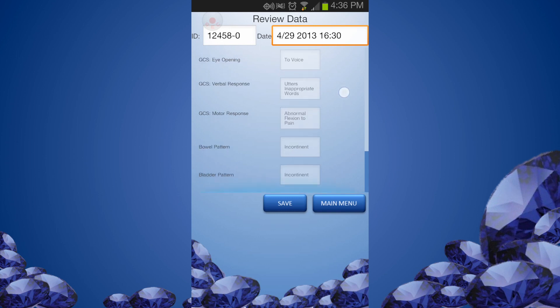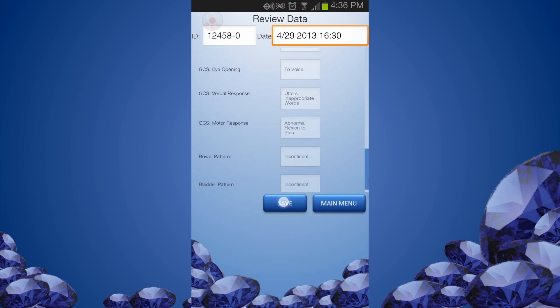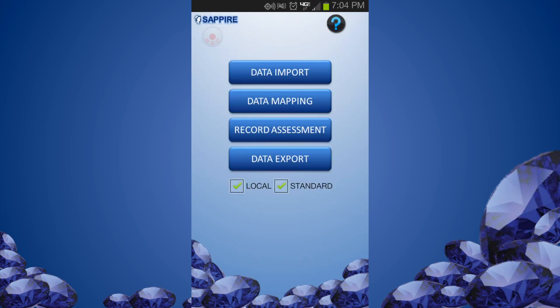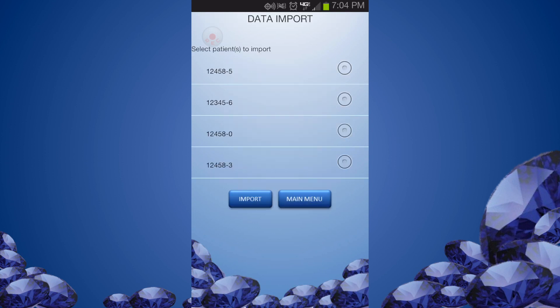After completing the assessment, you can review the data. Next, we will document Braden scale assessment.